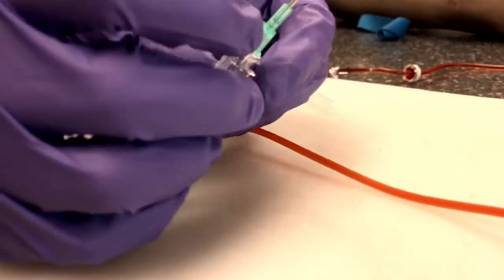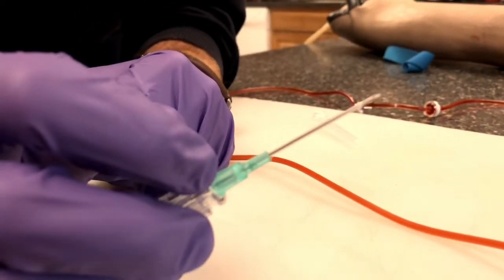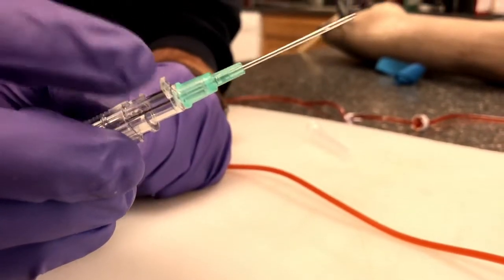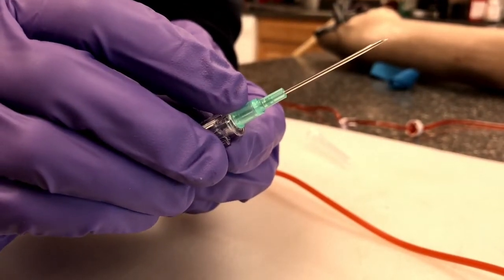Next, two common things that will happen. One, it's very worth noting that the catheter is proximal to the tip of this needle, right? So you can see quite clearly where the catheter is, right up in here. So what that means is that the needle will be introduced into the vein prior to the catheter.